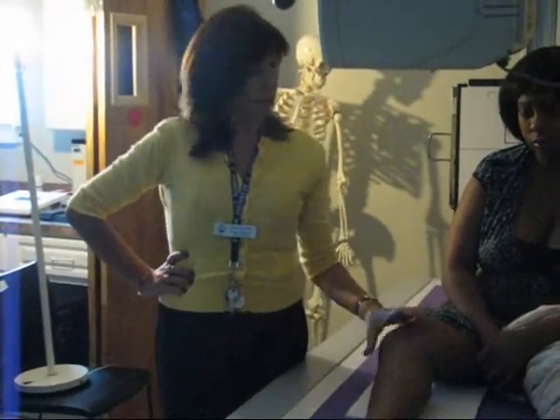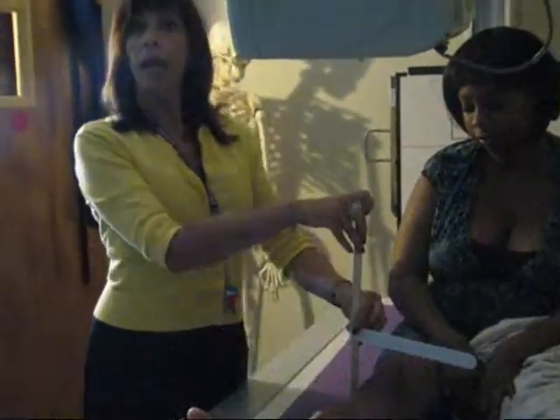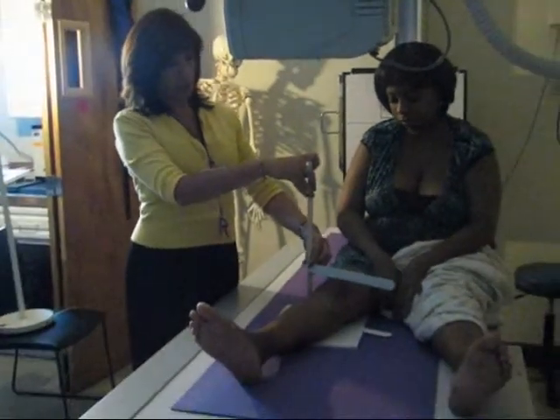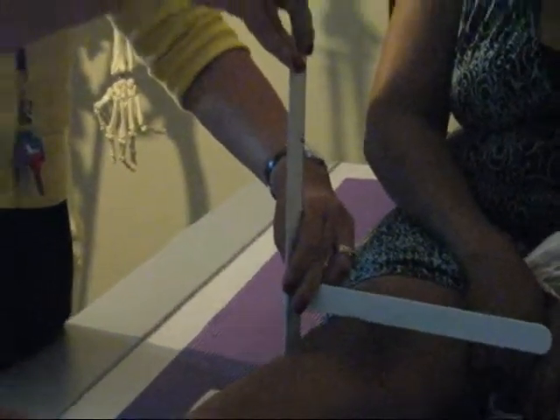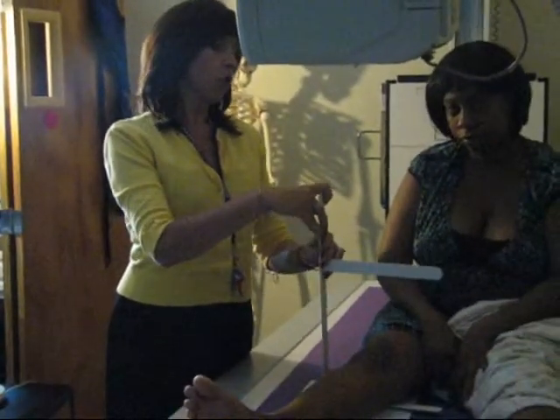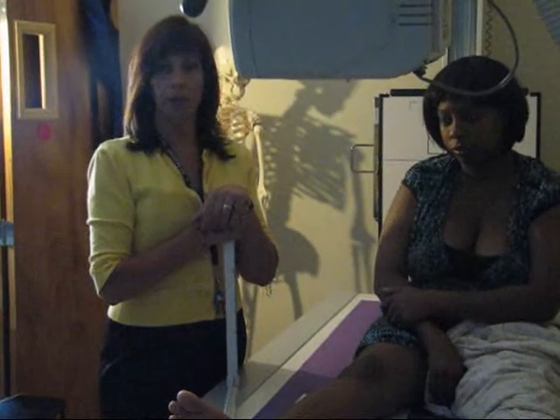If the knee is like hers, pretty small, we measured hers, and her knee comes to about 10.5 centimeters. We were measuring in inches. The cutoff is usually about 12 centimeters. Any body part thicker than 12 centimeters should require a grid. So in this case, we did tabletop because hers was still under the limit.